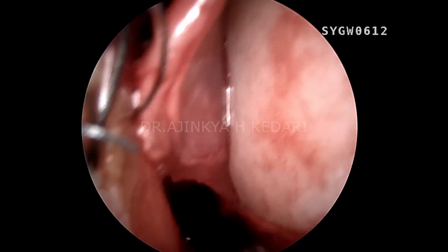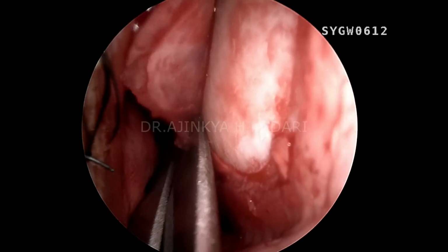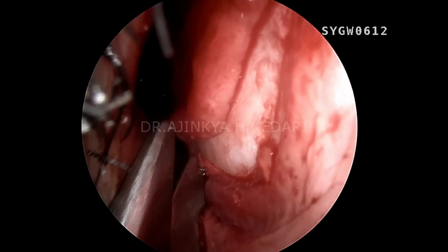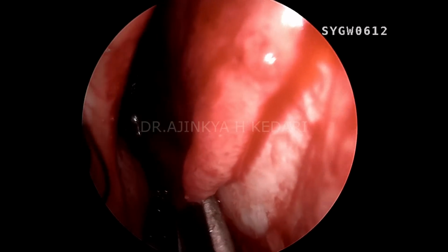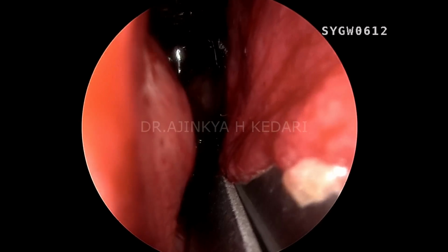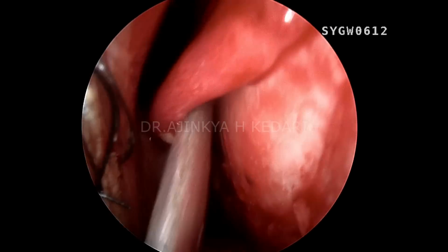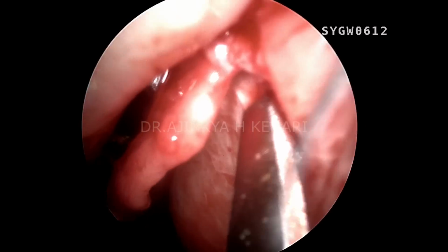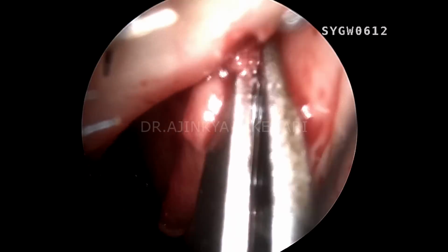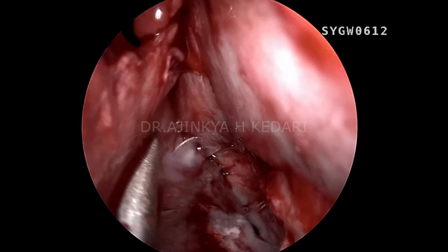You can see there was a superior septectomy done for the window to go for a binostril approach. Keeping that in mind, I need to cut the superior and the inferior incisions for my Hadad flap. I can go and cover the entire floor depending on my size of the defect. You can see I'm taking a superior incision right now. So you can tailor the Hadad flap.